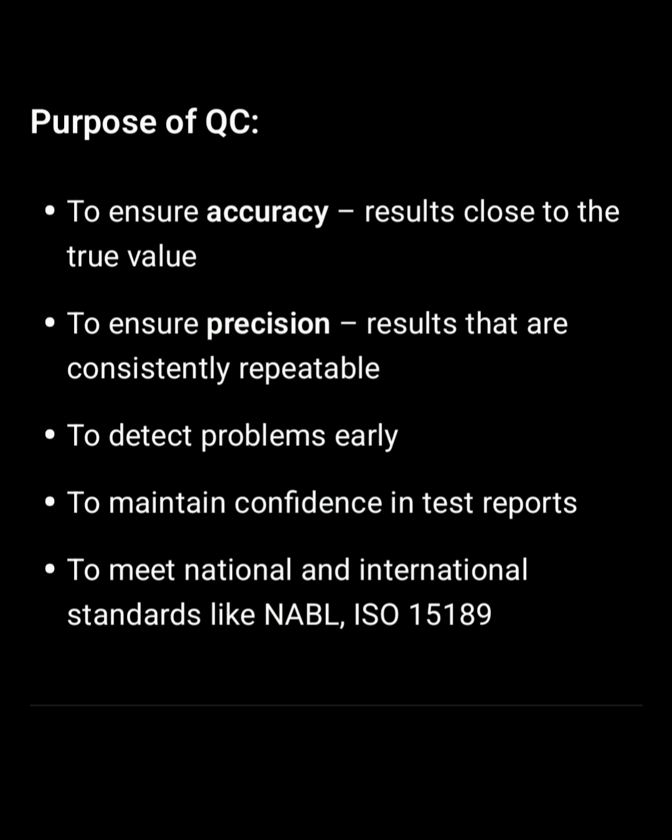Purpose of QC: to ensure accuracy, results close to the true value; to ensure precision, results that are consistently repeatable; to detect problems early; to maintain confidence in test reports; to meet national and international standards like NABL, ISO.